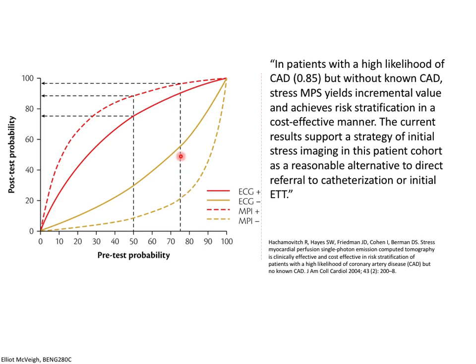And so there's a huge dynamic range between a positive and negative test. And so that's why basically almost $1 billion a year was spent on this test because of results like this that were published. And because you can indicate which patients more than likely should be treated or go to the cath lab.